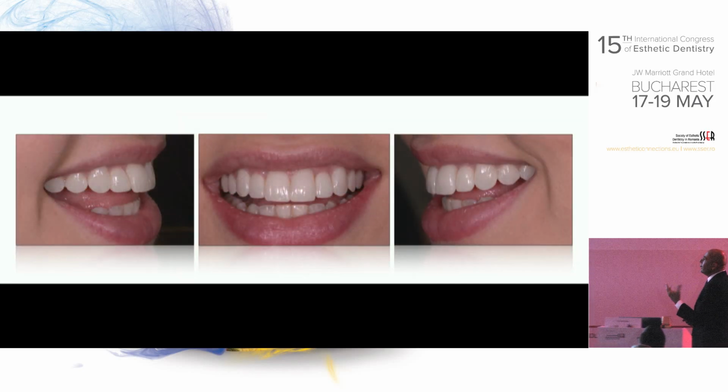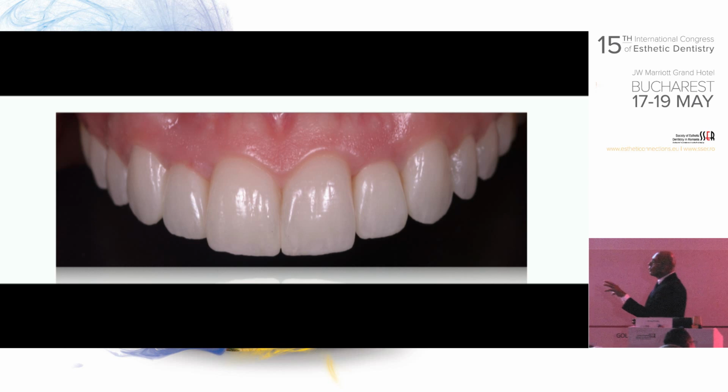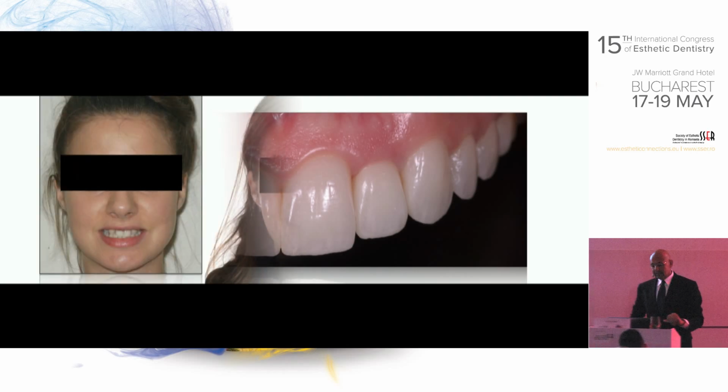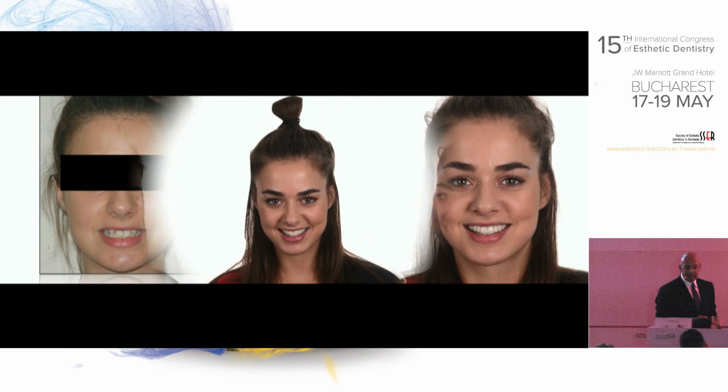So this way, we managed to set everything in the right place, being prosthetically driven, and towards the end, with all the soft tissue, there is no more depression on the laterals, all fitting in the best place. And these are the steps: before ortho, after ortho, and this is when we're done with that case.